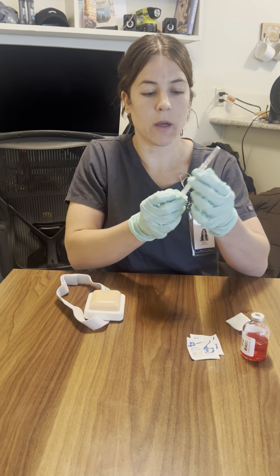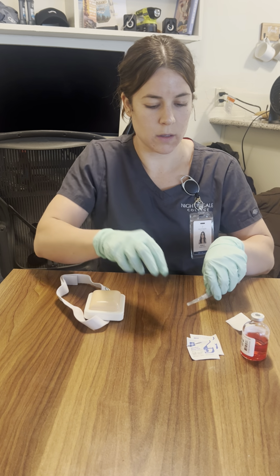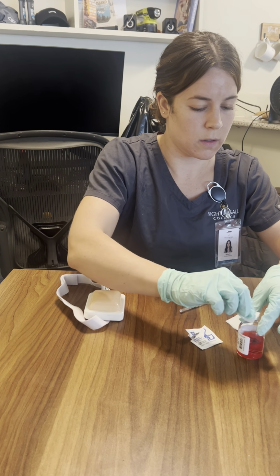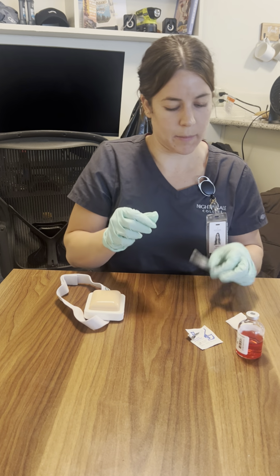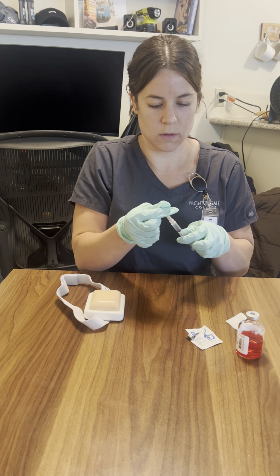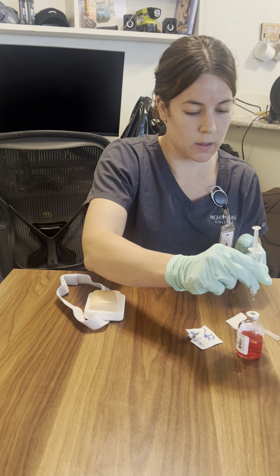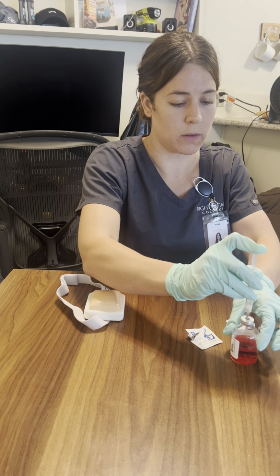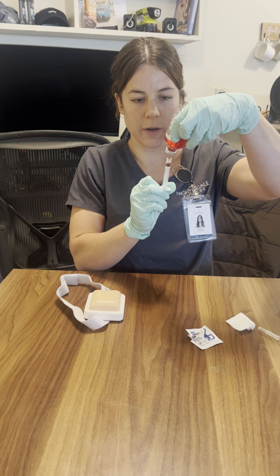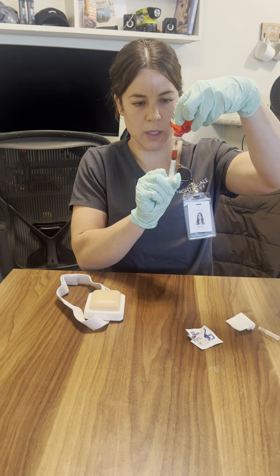So I'm going to begin by withdrawing 1.5 milliliters of air. I'm going to go ahead and clean off the top of the vial. And then I'm going to go ahead and uncap the needle carefully. It's sticky. I'm going to inject the air into the vial. I will turn it over and withdraw 1.5 milliliters.